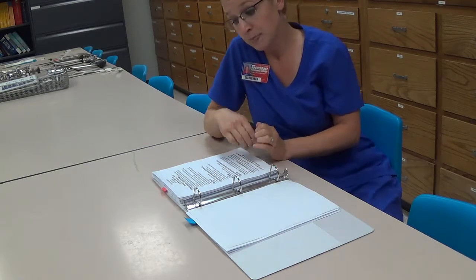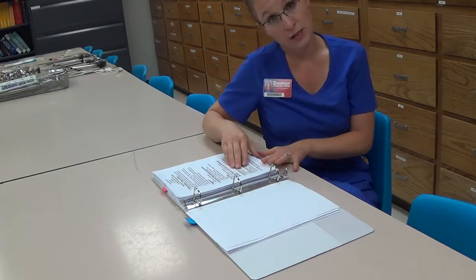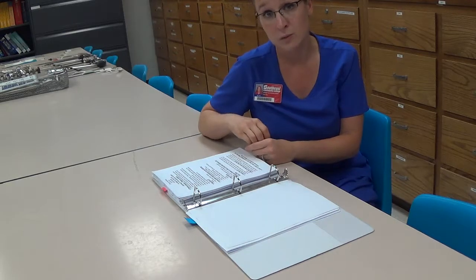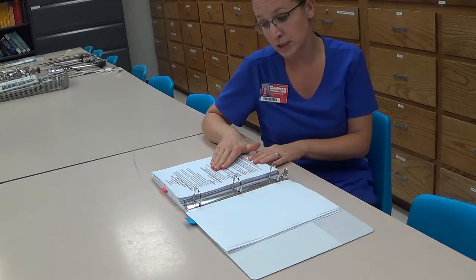So as you look at this description, you can see that it tells you the various different types of drapes that you'll want to have available. So make sure that you're squaring off, showing the students how to utilize linen or blue towels or non-disposable towels, depending on what you have available in your facility. And then also the paper sticky drapes, or the utility drapes, the paper square offs, and showing them the technique of how to make sure they're not unfolding too low, how to cuff their hands and apply those to the field.